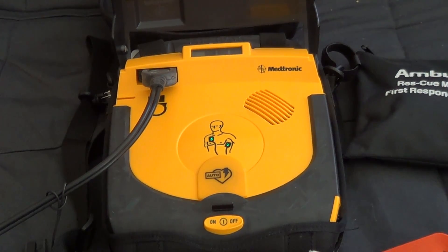Do not touch patient. Evaluating heart rhythm. Stand by, preparing to shock.